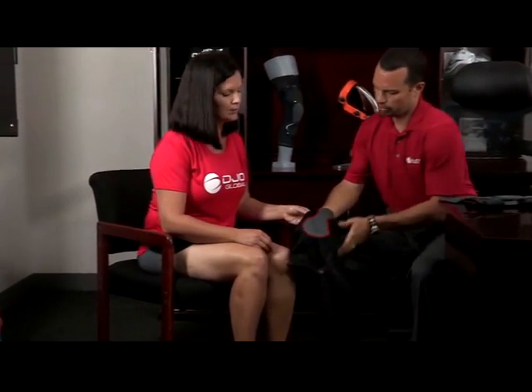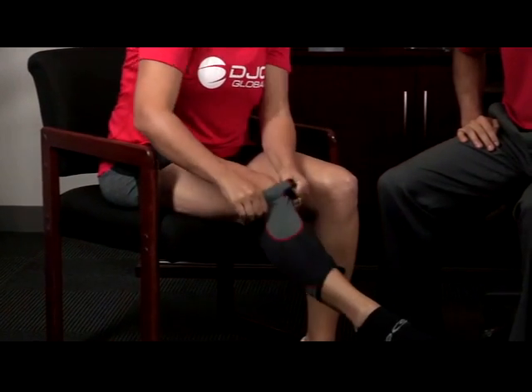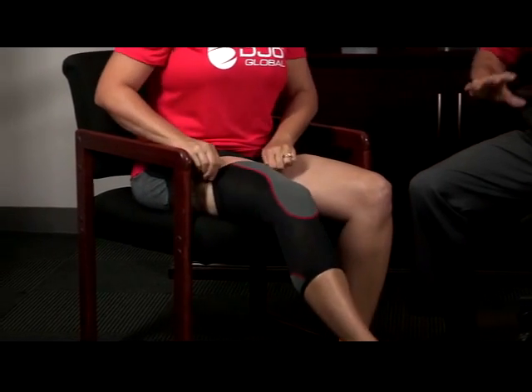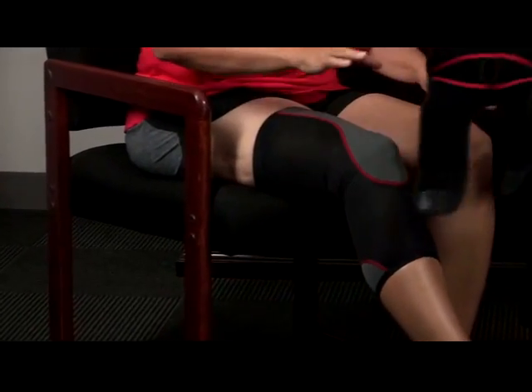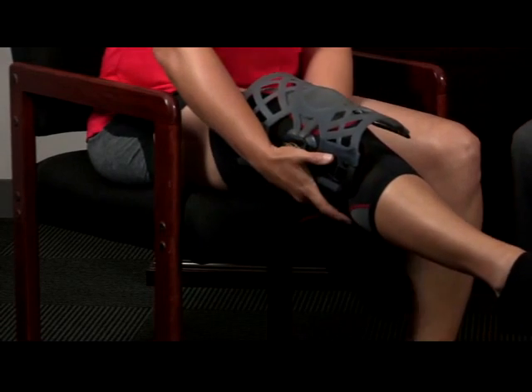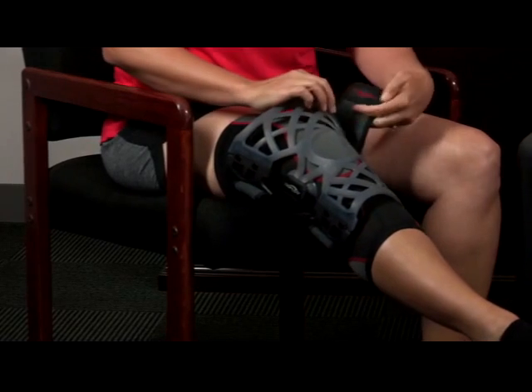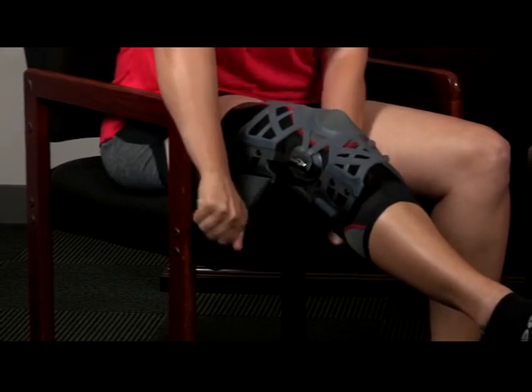Now we're going to demonstrate how to apply the knee sleeve and we'll put the brace over the knee sleeve. Amy, this hourglass shape is going to go right around your kneecap area and you're just going to pull it straight up on your leg. The knee sleeve can be used for a little added compression and a little more comfort. Again, the opening goes right around the kneecap and you're going to bring the straps through on the calf and the thigh. Just at first applying it gently and then you'll go back and readjust nice and snug.